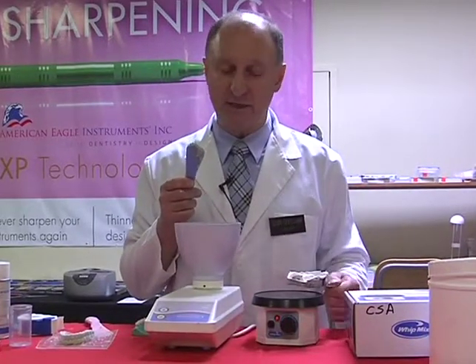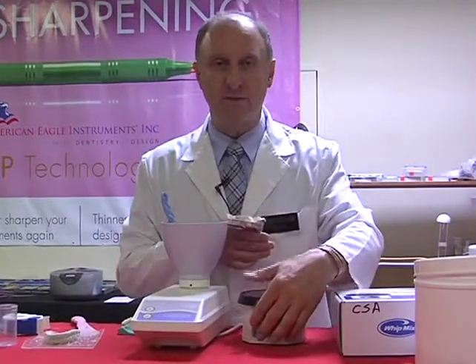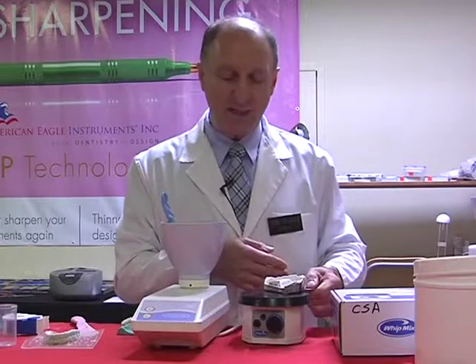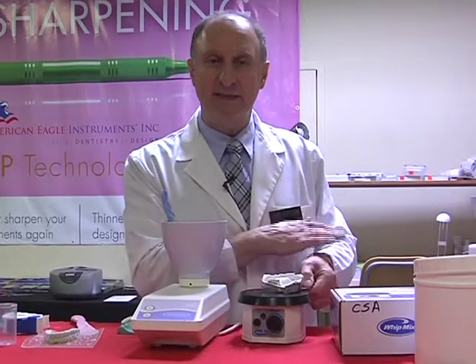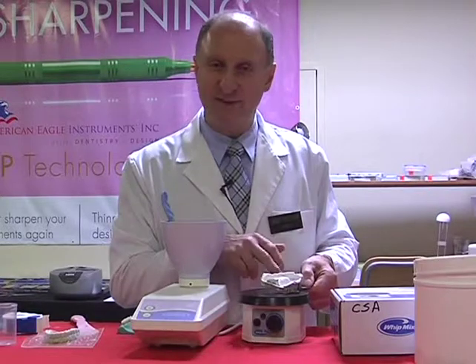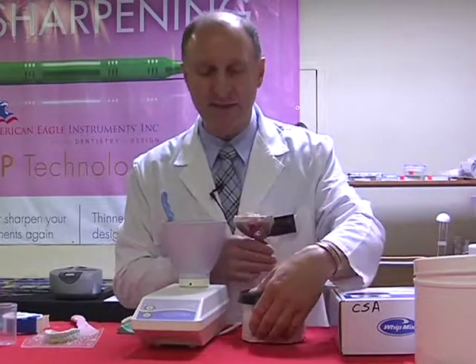Don't hold it down hard, because if you hold it down hard, let's turn this off for a moment so we can hear. If I hold this down hard, what will happen is all the vibrations travel through the tray into my hand, into my arm. It feels really good, but it doesn't do anything for the impression tray. I want to hold it down nice and lightly. So let's turn this back on again.